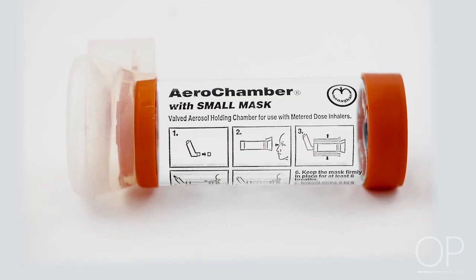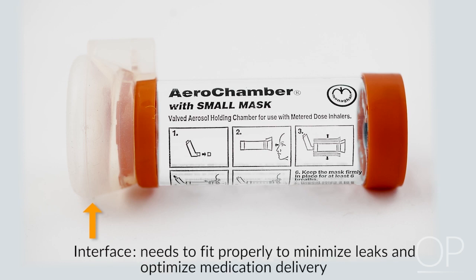I've selected a pediatric-sized chamber with an appropriate mask for this patient. Some components of the chamber itself. The interface. An appropriate size interface is essential to minimize leaks during use and optimize delivery of our medication.